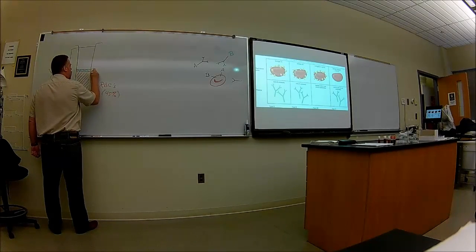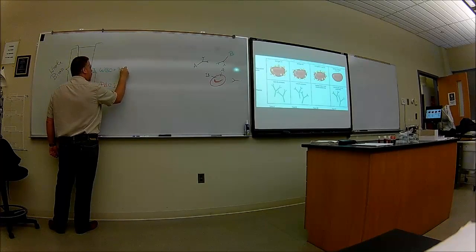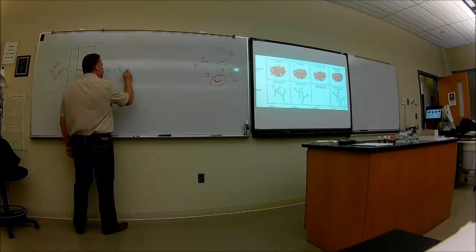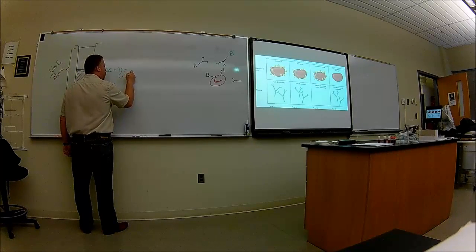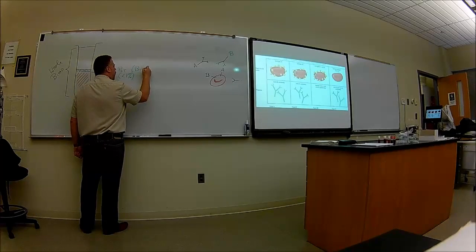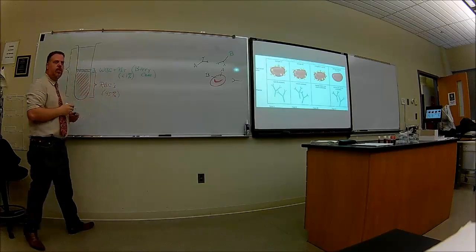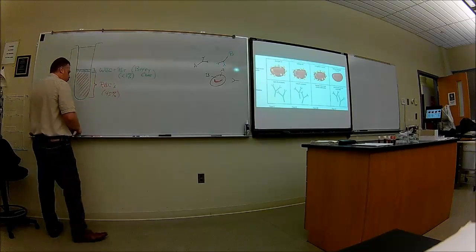And what is that going to contain? The white blood cells and the platelets. That's going to make up about, well, less than 1%. It's also known as the buffy coat, or buffy layer, because it looks white. When you look at it, it's actually white.